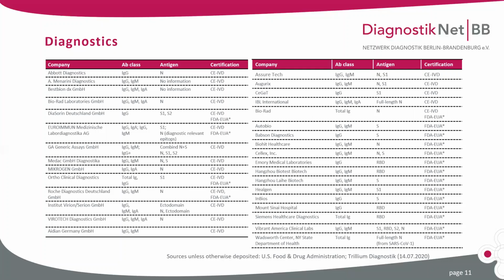It is said that it is of the same validity, but just quicker. Nevertheless, some additional validation has to be taken into account, and you have to revalidate that as a user in routine diagnostics.